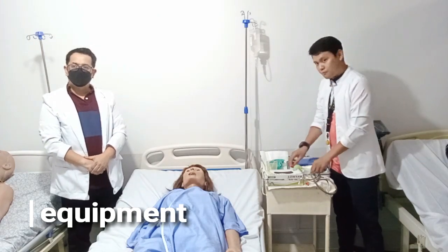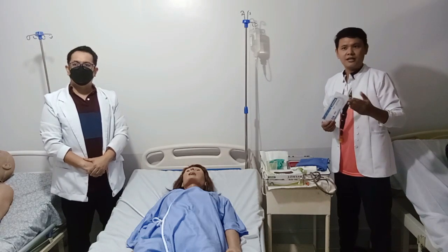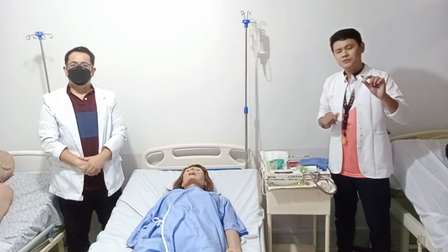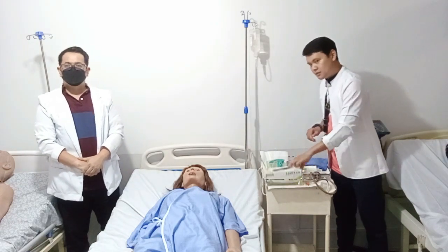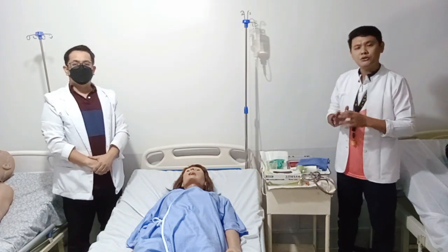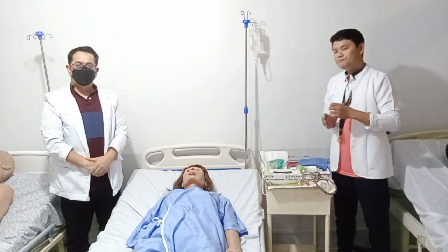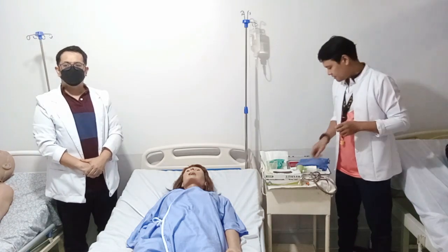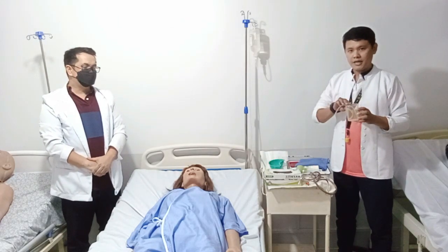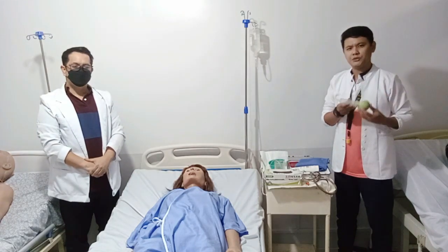For equipment: number one, we will use a large bore or small bore tube — preferably non-latex if available. We also need non-allergenic or adhesive tape, preferably one inch, but half inch is acceptable. We're going to use clean gloves or medical gloves, because this procedure only requires a clean technique and not a sterile one — but if you wish to use sterile gloves, why not? We will also use a water-soluble lubricant. A glass of water with a straw, and a 20 to 50 ml syringe with a catheter tip — or an Asepto syringe, which is most commonly used in the hospital.